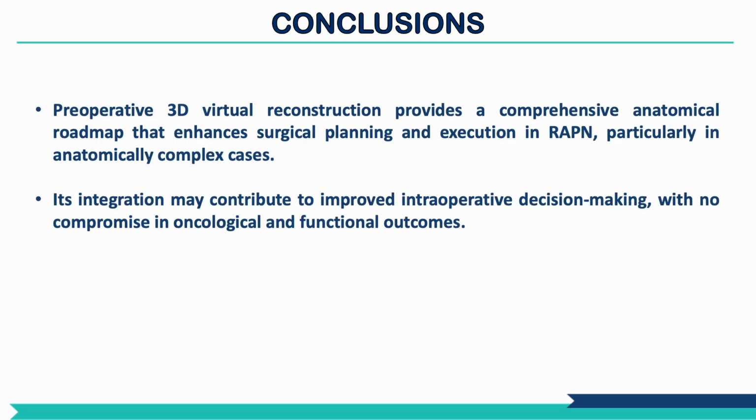Preoperative 3D virtual reconstruction provides a comprehensive anatomical roadmap that enhances surgical planning and execution during partial nephrectomy, particularly in anatomically complex cases.